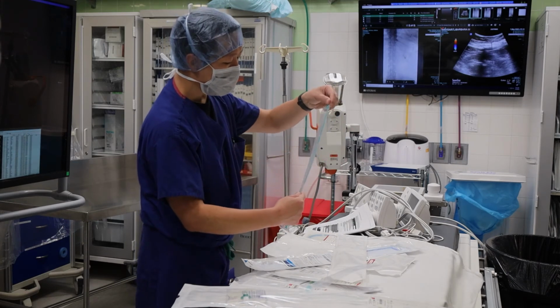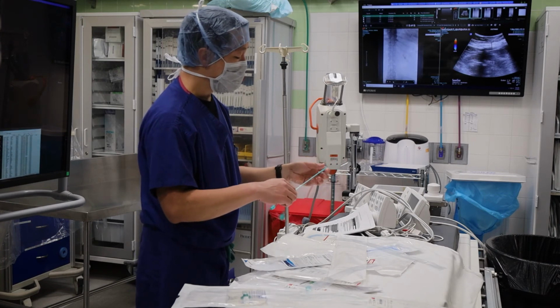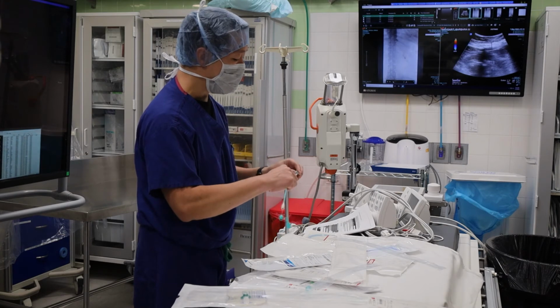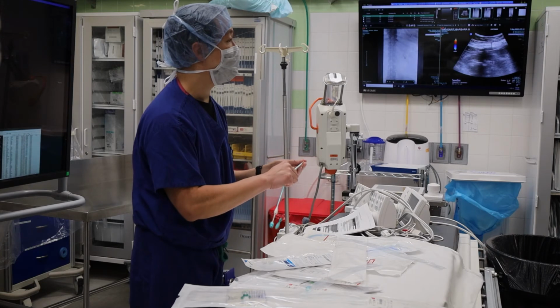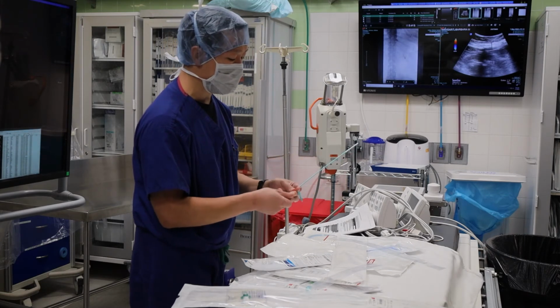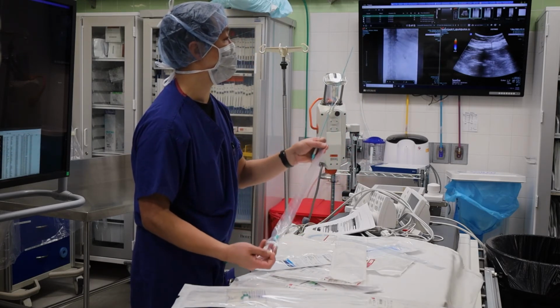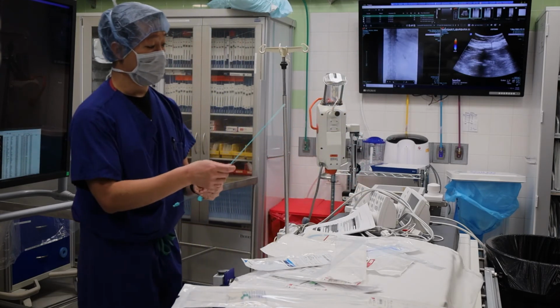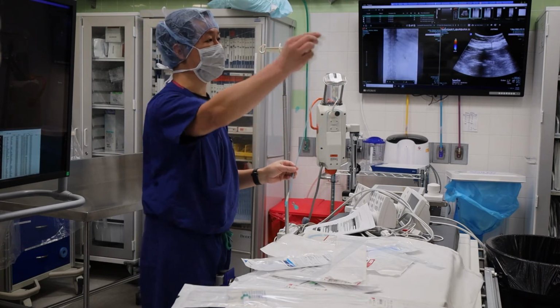Well, when you're making that initial hole in the body, it's really hard to do that even over an Amplatz sometimes, because we all have just a lot of stuff in that part of the body. You've got muscles, sometimes a rib in the way, you've got all this stuff. And so this allows great pushability for the metal stiffener when you're making an initial tract. Once the tract matures, or on exchanges, we don't use this because this is too traumatic and we switch to this.